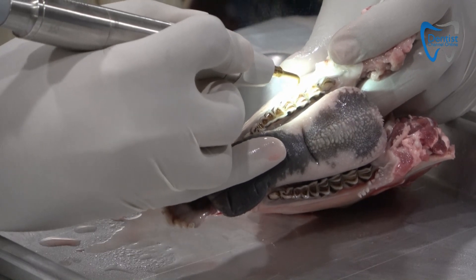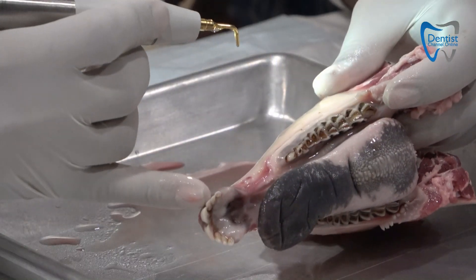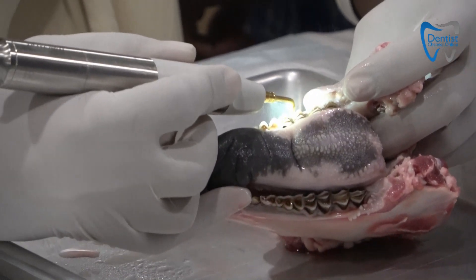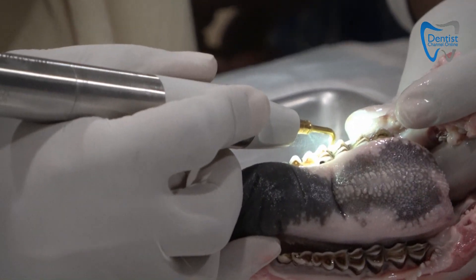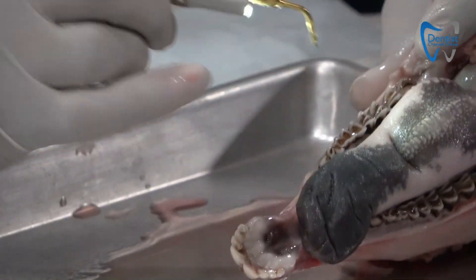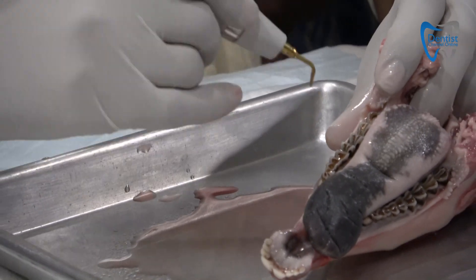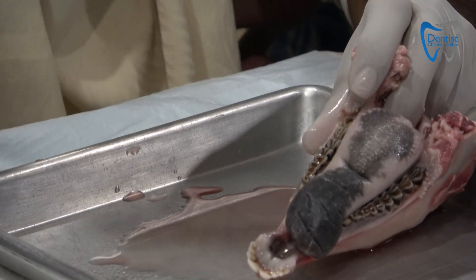Once I raise the flap, I can show you what is actually happening inside. There is tissue, there is no bleeding, nothing. There is no charring of the tissue or anything. This is how you have to go inside — then take a forcep, rotate it, and the tooth will come out. Usually it doesn't need much force. Only when you have a root piece you have to go all around and raise it.